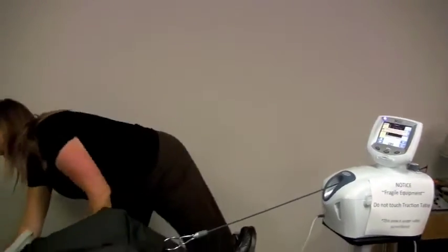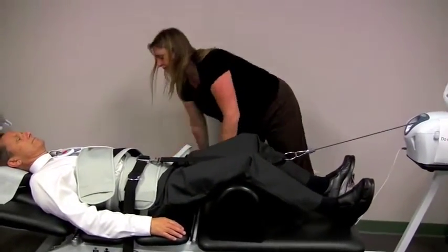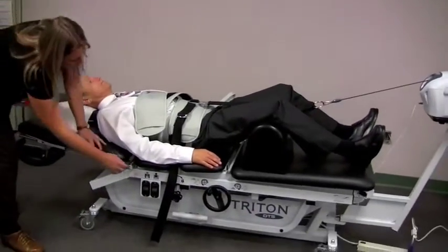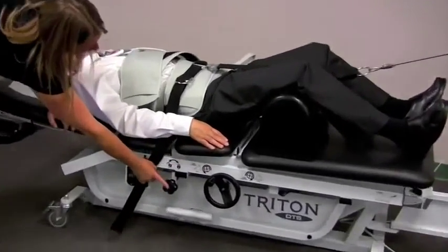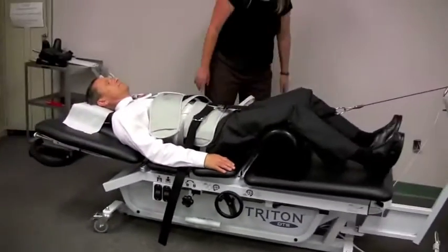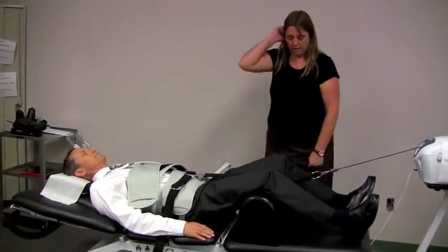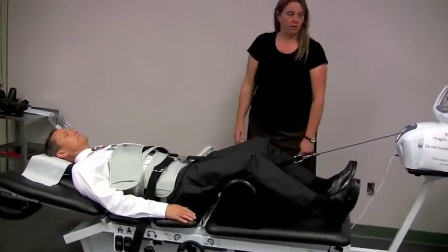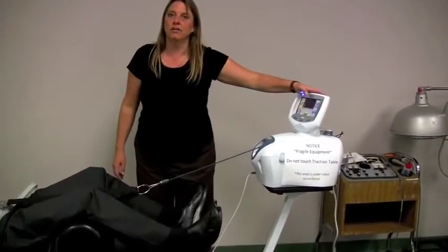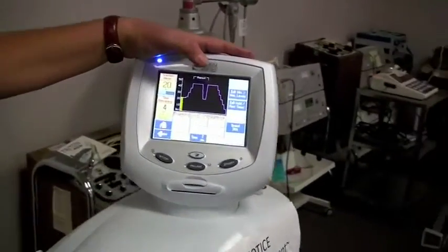It says release the table to unlock it. And it really is already unlocked. Here's the button where the unlock button is. And that's going to make the ability of this whole table to move. Now, if at any point you don't like this, just hit that stop button. So, right now, it's already raised up to 20 pounds pre-tension. So in that 30 seconds, he has 20 pounds on him. Probably not feeling much yet.